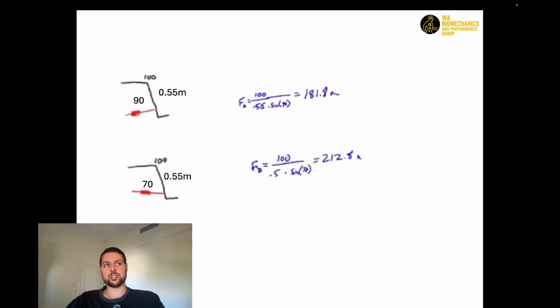So if we work backwards using that torque that we know is equal on both of those, and see what the dynamometer is telling us: if we do the top one well, like we have, set up at 90 degrees as we should have, we might tell the patient, look, unfortunately, your force expression has not changed that much since last time.